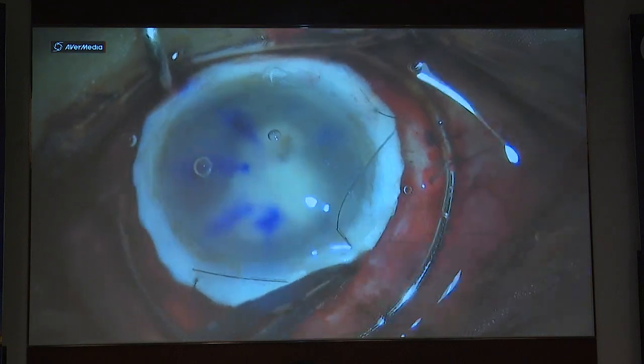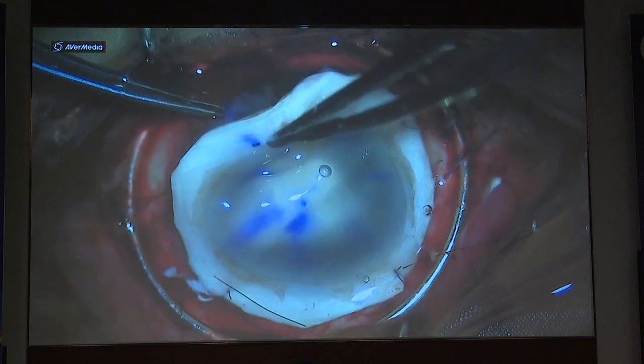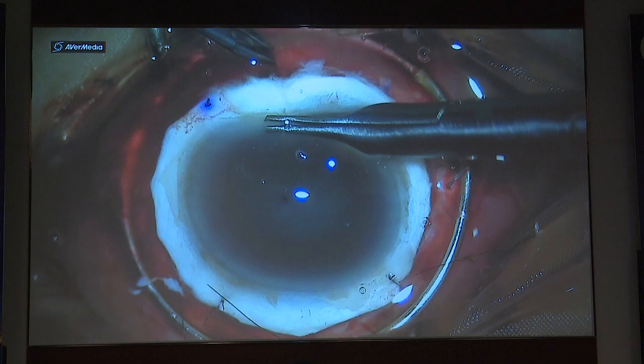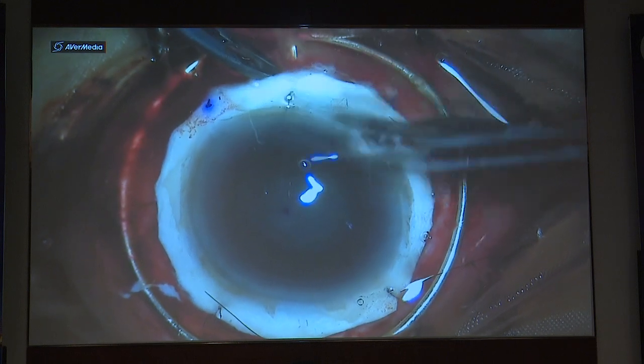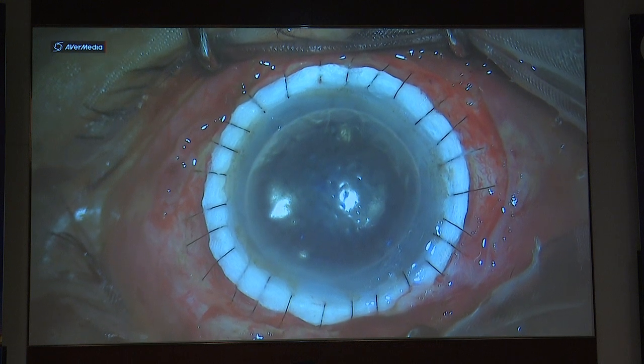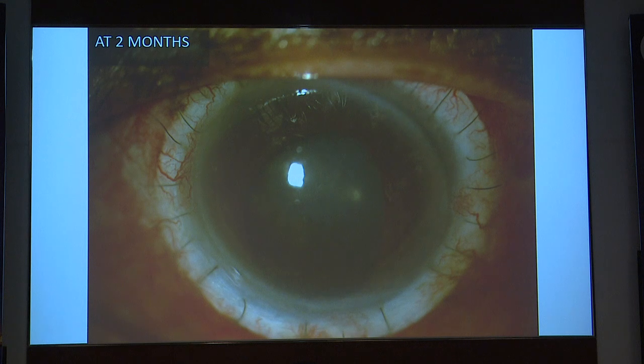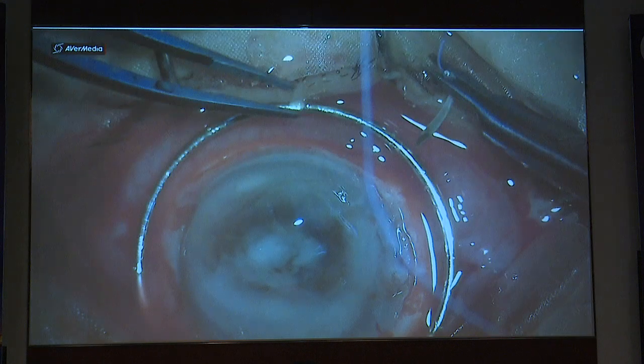Then slowly release the sutures of the host and, without damaging the iris or the lens, pull out the host. Now the chamber was closed and it was quite easy to suture with no positive pressure. This is the look at day 10. At 2 months, now at 6 months, his graft is failing, so he will be posted for a DSEK or optical triple.